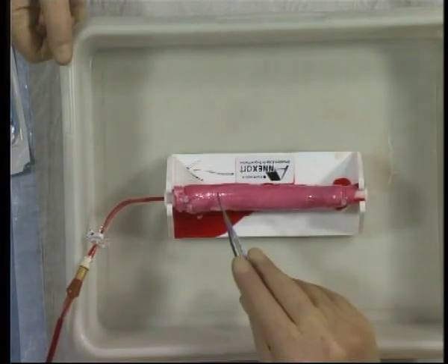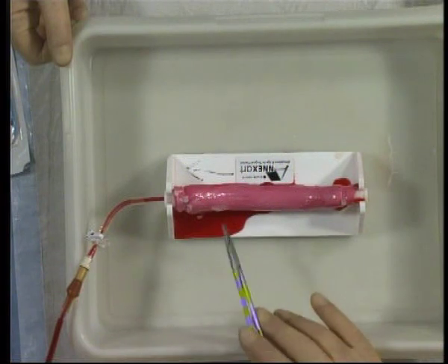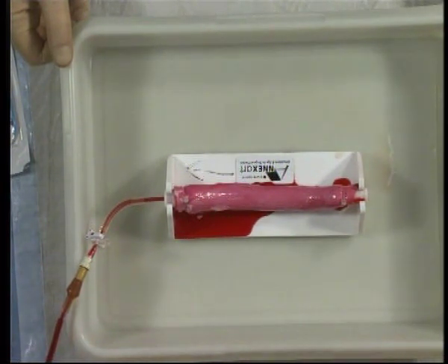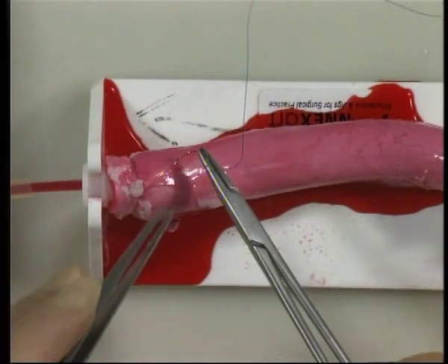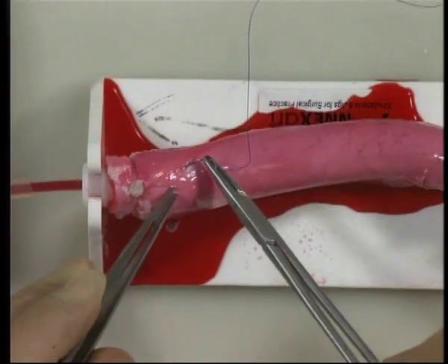Once you've established your perfused pig's aorta, the next stage will be to perform a purse string for cannulation. Using a 3.0 prolene, create a partial thickness aortic purse string of approximately 1 centimetre in diameter.